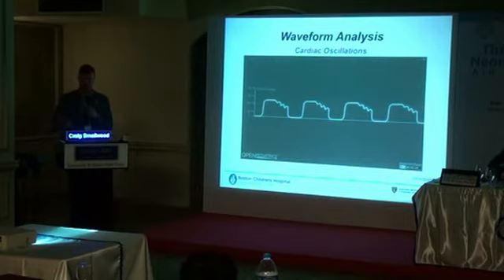What's happening is that at the end of exhalation, there can be very little gas flow. Sometimes it will manifest in a patient who has a heart that's beating strong. A lot of times we'll see these in our congenital heart disease patients. The heart basically is moving gas inside the thorax. So it's pumping enough, making enough of an airway disturbance that we're seeing these little oscillations in gas flow. What you can do is count the periodicity, and if it's basically exactly what the heart rate is, well, it's cardiac oscillations.